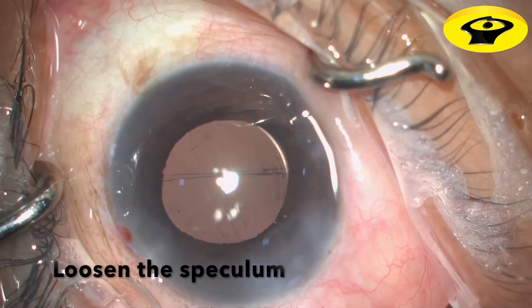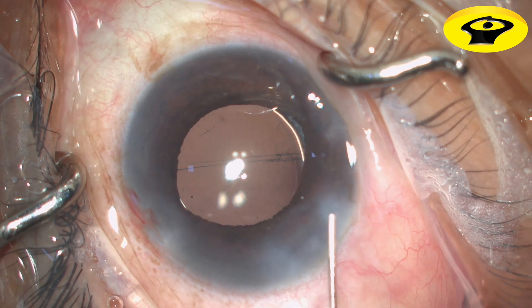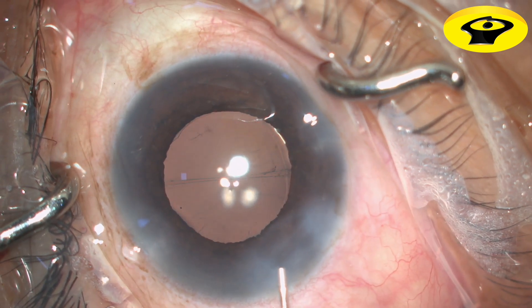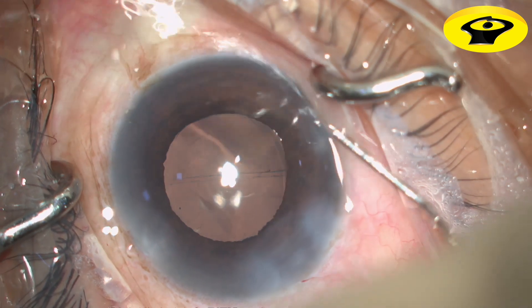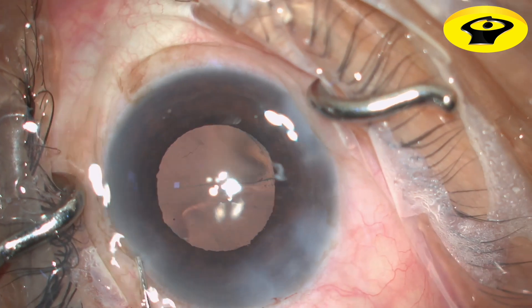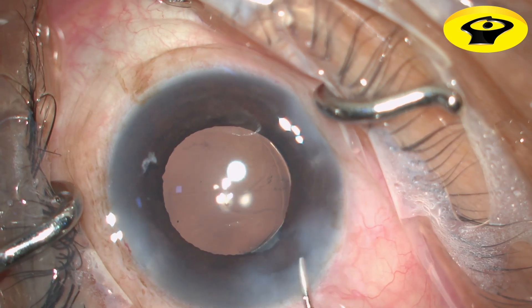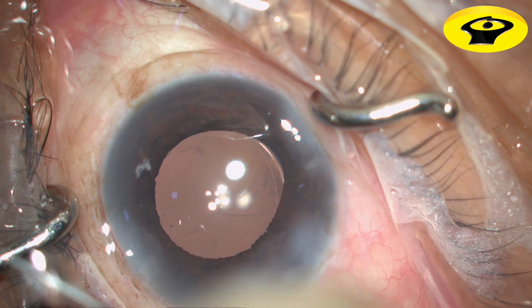Before hydrating the ports, I loosen the speculum a bit, then start hydrating the sides of the main incision and the roof of the main incision, then go to both sides of the side ports. I always give a constant irrigating flow so that while I come out, it doesn't collapse the anterior chamber.